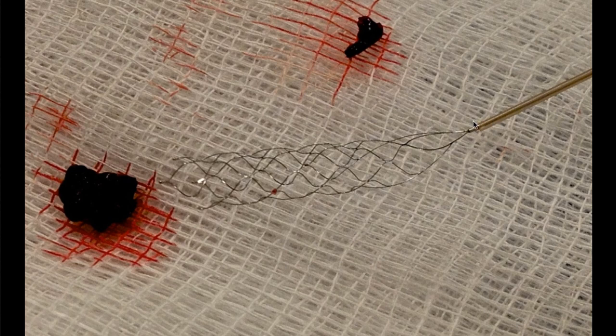So let's go over what we're looking at here. Here's the micro catheter. Here is the stent, the retrievable stent. And here is the blood clot that was blocking this patient's brain artery.